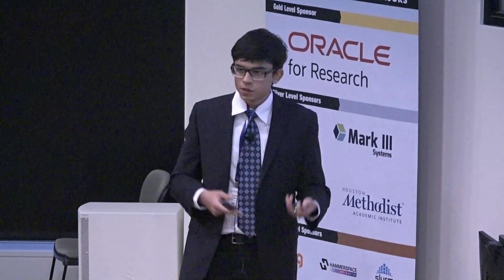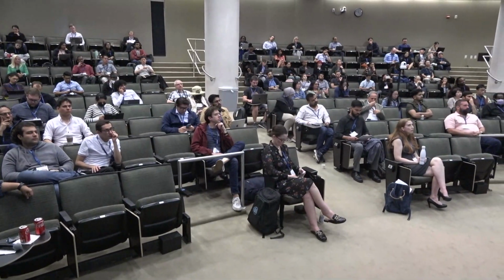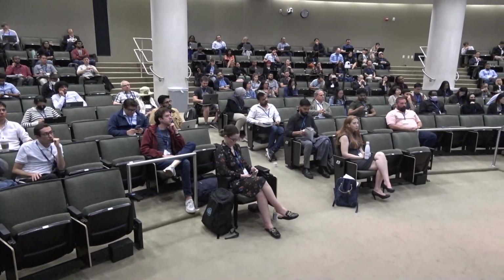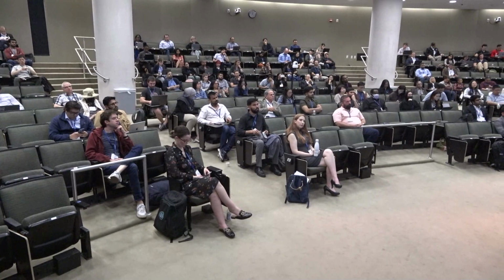But anyway, with these inference weights and videos, now we take the EchoNet models and we do some fine-tuning with them. Now this isn't just typical fine-tuning. Now we're bringing in new labels to train on. Instead of using the Echo EF from TCH's datasets, we use the CMR EF. And these CMR EFs are also from TCH data. The corresponding CMR EF label would be from the visit with the closest CMR visit in time to the Echo visit. So that's where we get these CMR labels from.